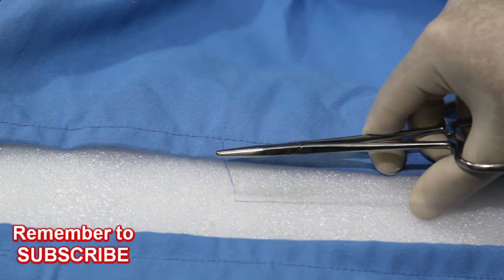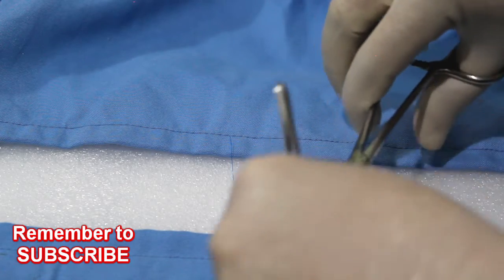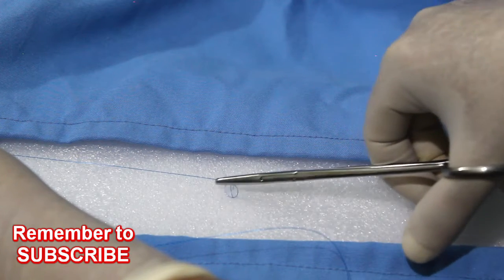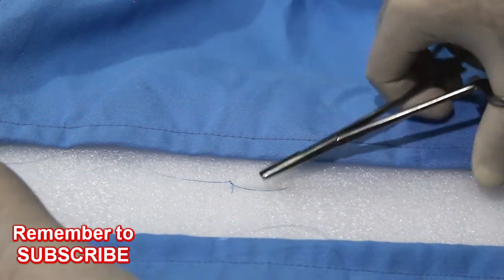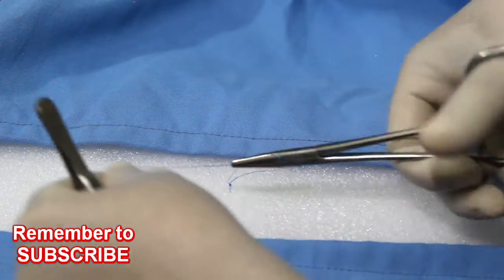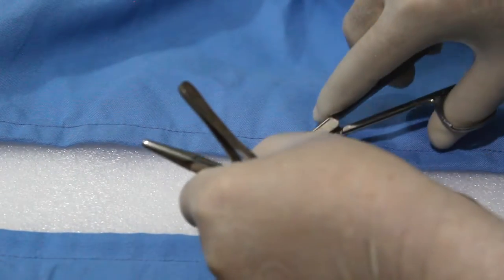Keep the short end as short as possible to minimize wastage of suture material. It is better to do two turns for the knot. The pull should be parallel to the line of wound for better approximation and closure. After the first throw, do the second in the opposite direction, and if needed a third. This completes an interrupted suture — then cut it.